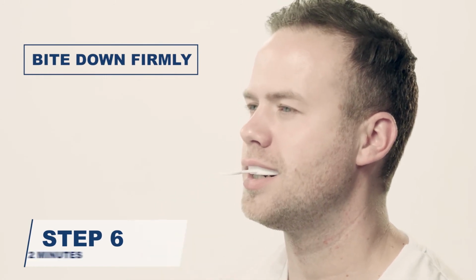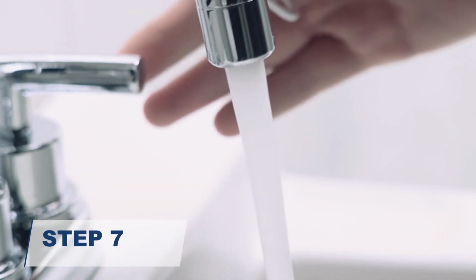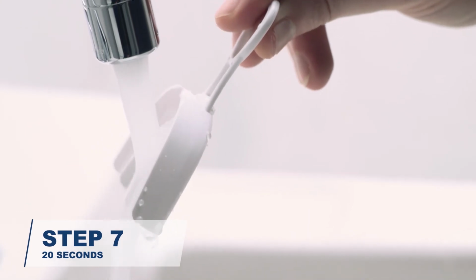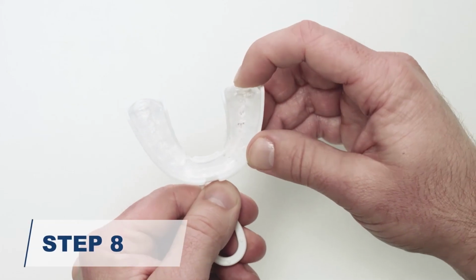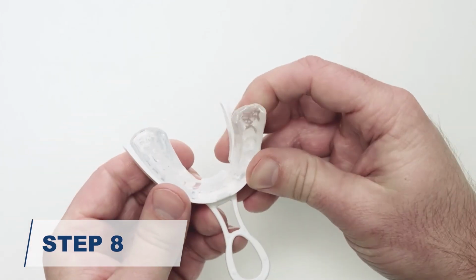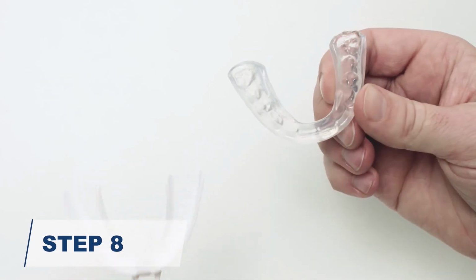Relax your bite, but keep the guard in place for at least 2 minutes while the material hardens. Gently remove the guard and tray from your mouth and rinse under cool water for at least 20 seconds. Finally, remove the dental guard from the fitting tray. Start by gently pulling the ends from each side of the fitting tray, then work around to the front.